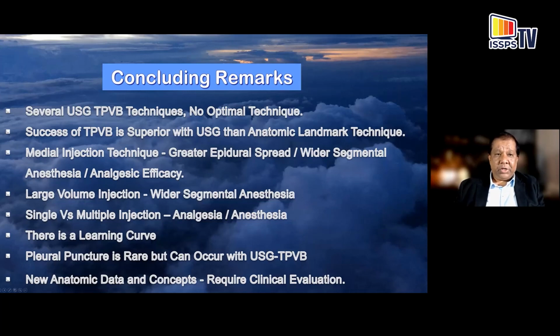The single level injections, although they produce comparable dermatomal anesthesia, which is statistically not different, need clinical validation when it comes to providing anesthesia where multiple injections are required. I doubt that single injections will live up to surgical anesthesia as compared to, say, a 3-level injection, which produces very consistent multidermatomal anesthesia. There is a learning curve.